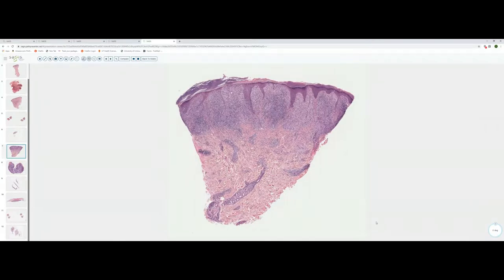So if we look at the pattern here, we've got a superficial and deep perivascular infiltrate occurring in concert with epidermal hyperplasia. And within the papillary dermis, a lichenoid infiltrate that kind of obscures the dermal-epidermal junction. So we've got psoriasiform lichenoid dermatitis. And you'll remember last week, we discussed that when you see this pattern, three things you need to think of right away are lichen striatus, secondary syphilis, and mycosis fungoides.